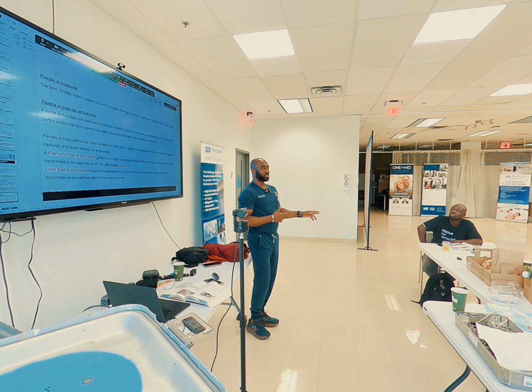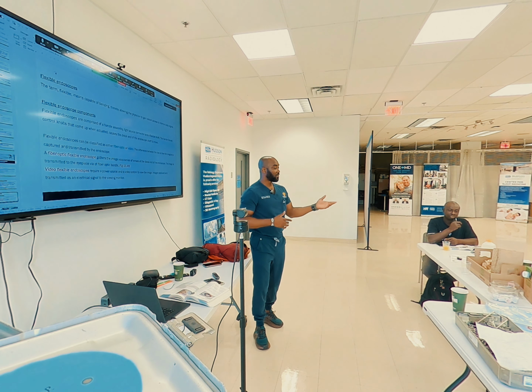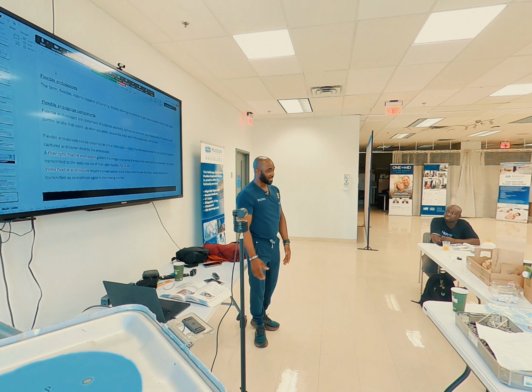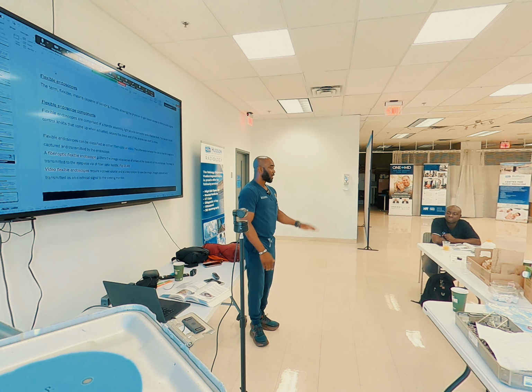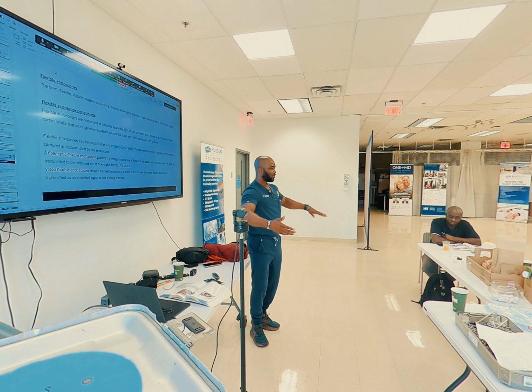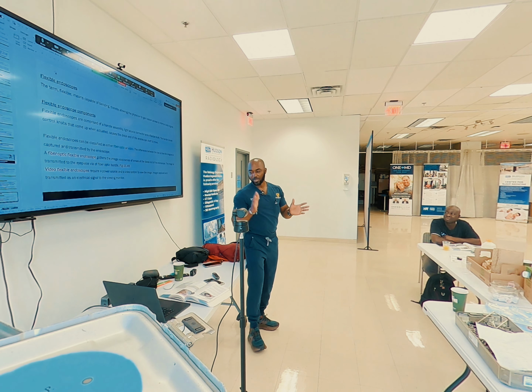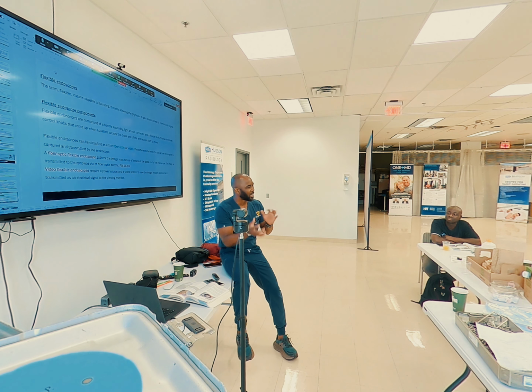Treatment should not be rushed in this case. And if they are, they can send them to a visiting hospital, because even if you treat that patient, the patient comes back with a hospital-acquired infection of hepatitis C, you ruin that person's life. So, do we get that clear about high-level disinfection over here? Is it clear, or is it still confusing? I know it's a lot of information, but I keep going back because I want you guys to understand.